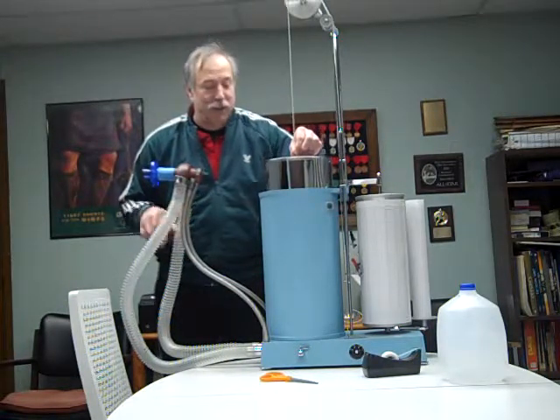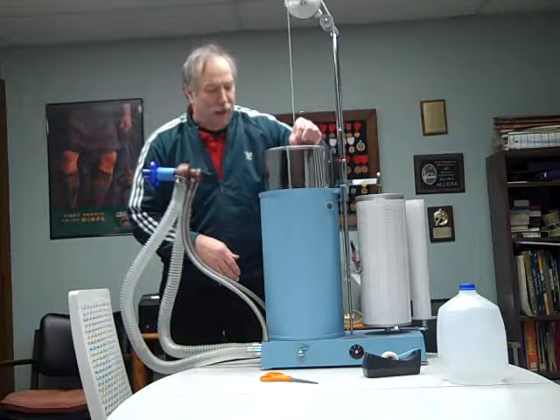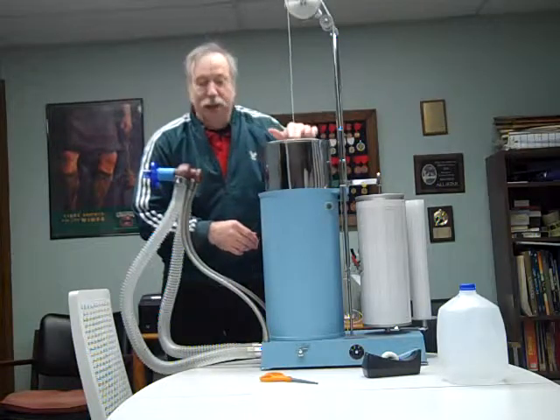Usually before the patient does this, I will flush all the air out of the machine first so that there's fresh air in there and it's not old or stale air. Next, we'll actually have a patient run through a test and we'll take you through that process.